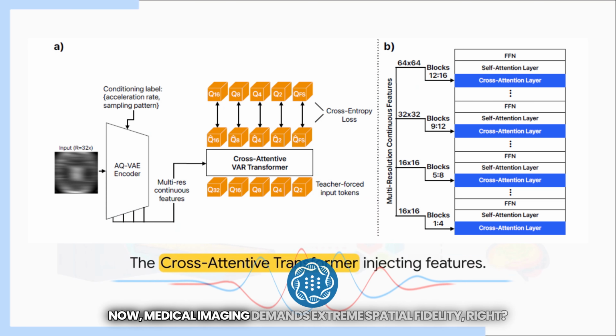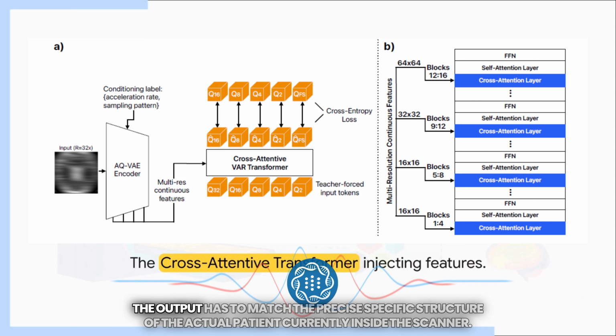Now, medical imaging demands extreme spatial fidelity, right? You can't just generate a generic, healthy-looking brain. The output has to match the precise, specific structure of the actual patient currently inside the scanner.